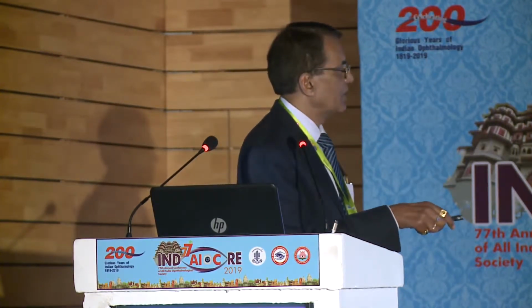Now, there has been evolution in the OCT: the time domain, then spectral domain, then swept source OCT, and because of swept source, the tissue demarcation has become very accurate. Now, just quickly to save time, this is the usual printout of an OCT machine. I'll not go into detail, but mainly what you are seeing, as I told you, is the RNFL thickness along the optic disc. That is how it is presented in this printout.